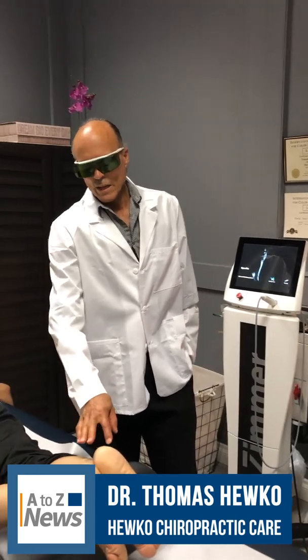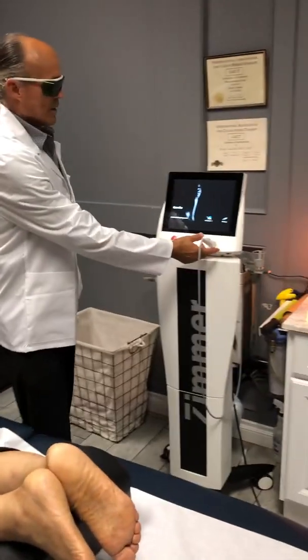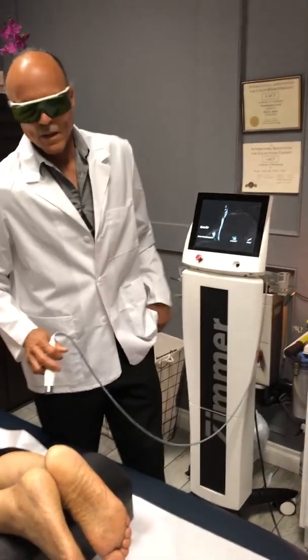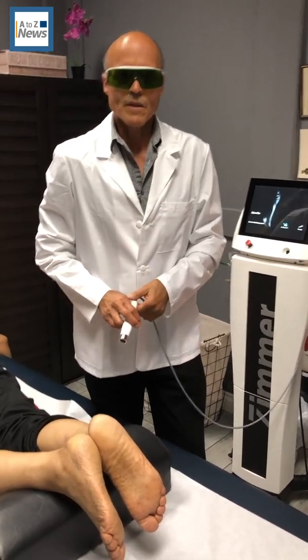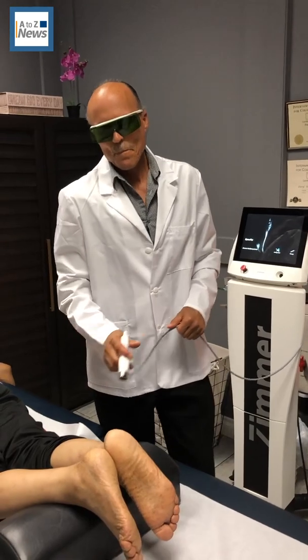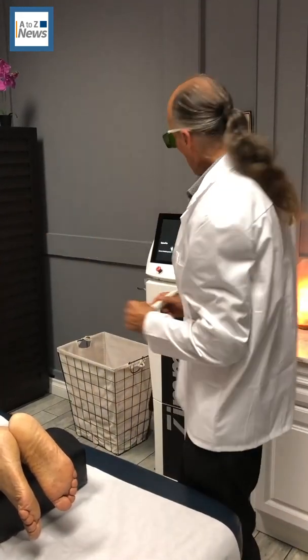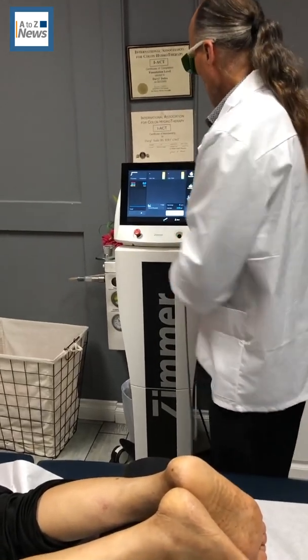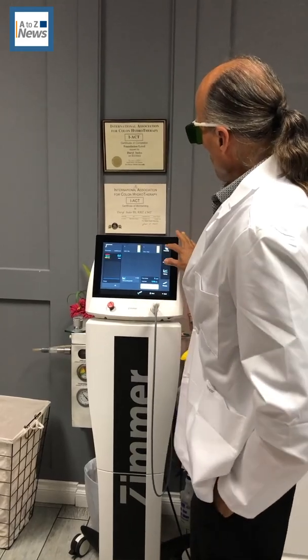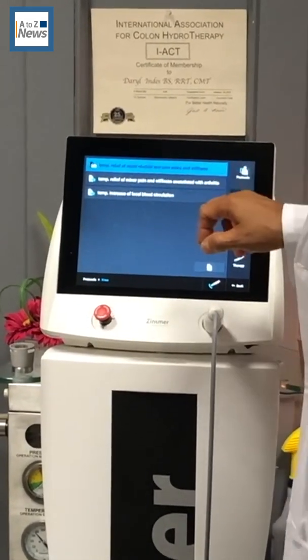Hello, I'm Dr. Hugo, chiropractor here in Santa Ana. We're going to treat an ankle today with the Zimmer Optum Pro laser machine, which we seem to always get results with on every condition. Working on the musculoskeletal system, patients always get up and say they feel better. One thing great about the machine is it's very easy to handle, quick and fast — it's all just push-button screen.